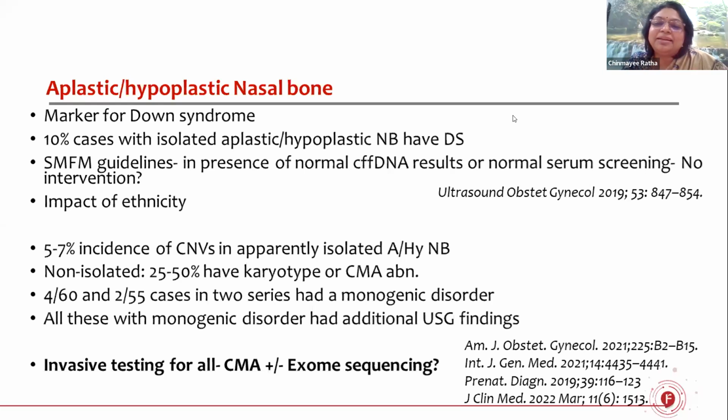See, even this can be tricky now because we have a lot of donor conceptions. We have mixed genetics, mixed ethnicity, different generations with different ethnicity. So I just deal with the fetus individually. No, I think the safest method is that once you find a positive feature, you need to evaluate to the extent you can, because there are no shortcuts. I think that is the most important message that we need to convey.